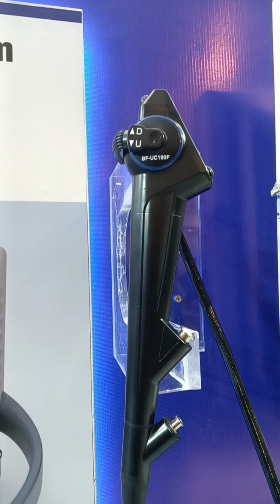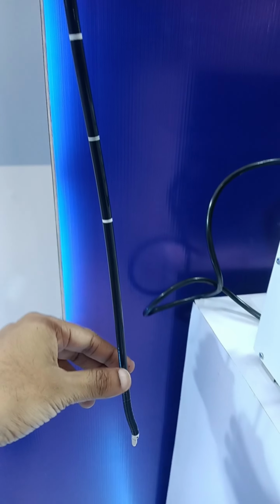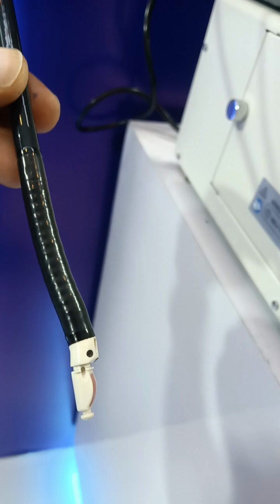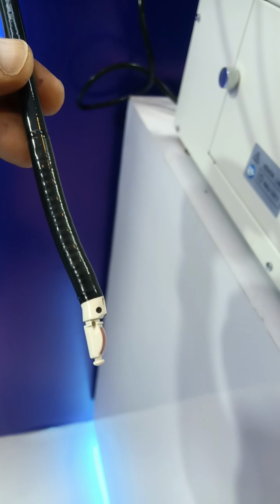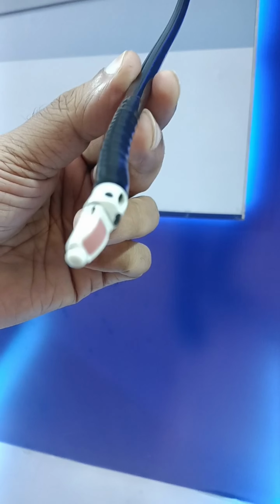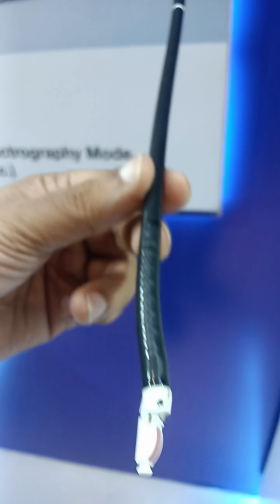Now what you see here is a convex EBUS probe. The advantage is that it allows real-time imaging and thereby helps in the sampling of tissue. As we said, there is an ultrasonic transducer at the distal tip producing a frequency of 5 to 12 MHz, thereby we can achieve a tissue penetration up to 5 cm. This convex EBUS probe has the capability of displaying B mode, that is the brightness mode, as well as the color Doppler mode.